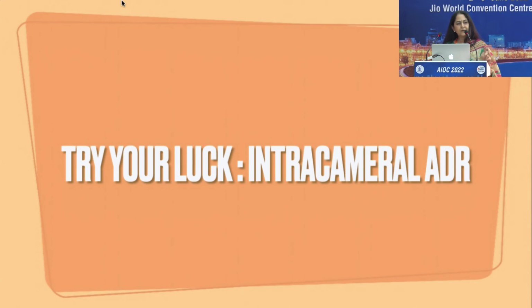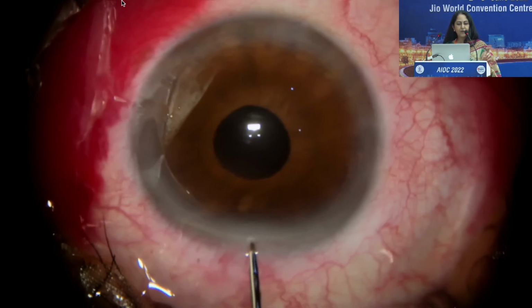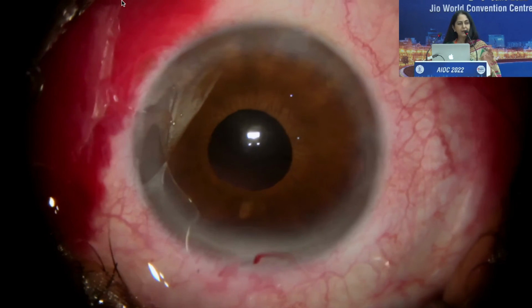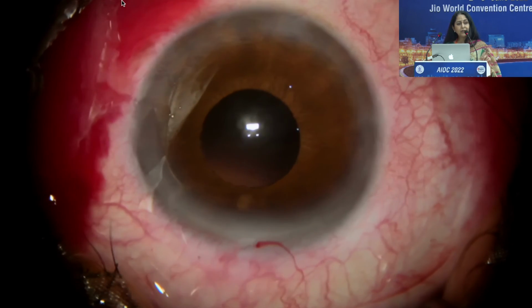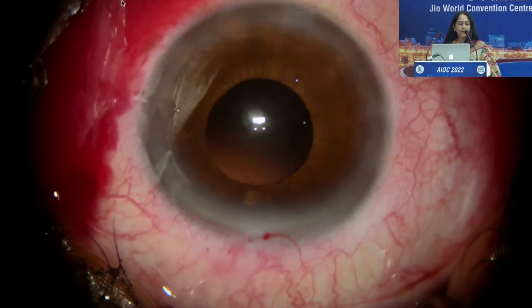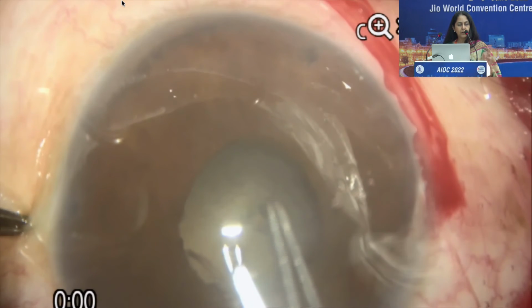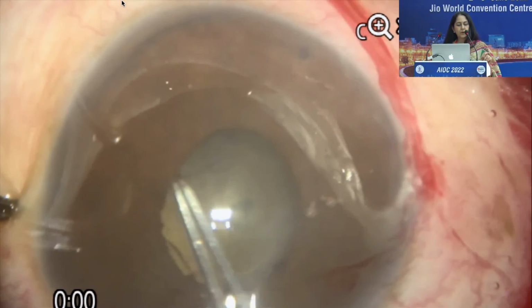So the first thing that we have to do is try your luck. We have the epinephrine in the OT that should be ready, and if you're lucky and you've put in the epinephrine, this pupil may enlarge considerably. Usually this intraoperative miosis happens after I/A. That's because you're trying to clean up the cortex behind the iris, and the pupil comes down with the fluid wave coming in.